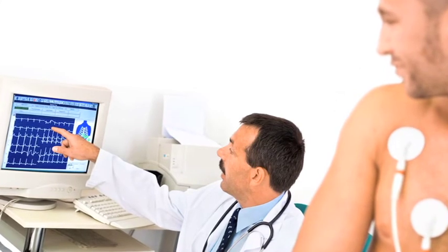At the end of the test, there's a cool down period where the patient continues to be monitored until they get back to their baseline vital signs. For people who cannot exercise, there are medications that can be used in place of exercise.